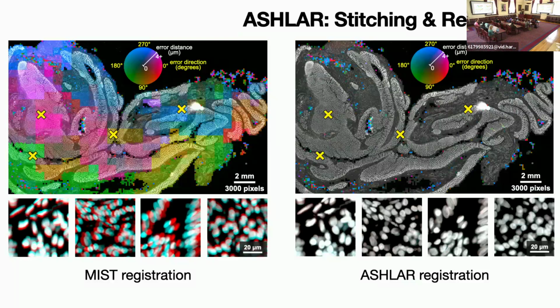So we came up with an approach of coarse block-based optical flow. We took 200 by 200 pixel patches, which is about the size of the inset panels you see on the bottom, and then walked that 200 pixel window across the image, did a local rigid registration, and said by what distance and what angle are those 2 patches shifted relative to each other, which is optical flow. We presented that on top of the image as a colored heat map, where the hue represents the angle, so red is to the right, green is down to the left, and so on, and the intensity of the color represents the distance.